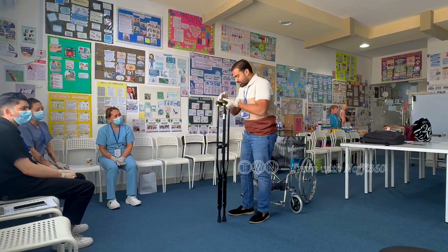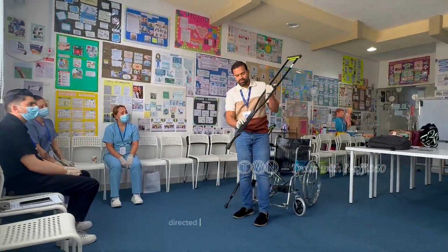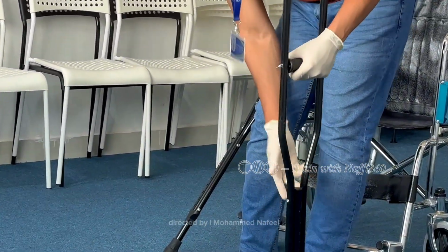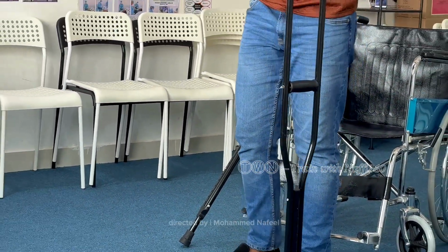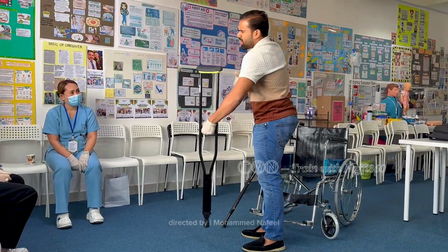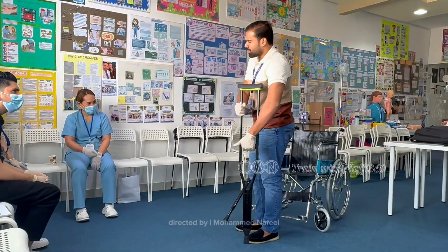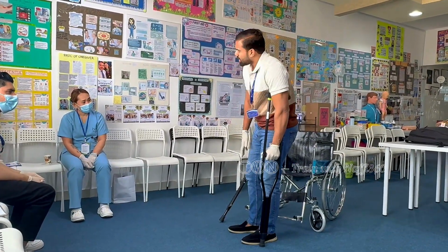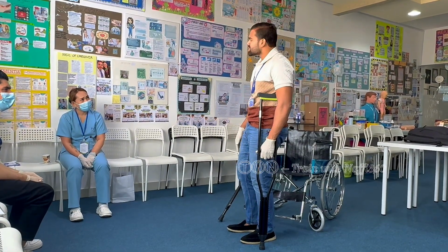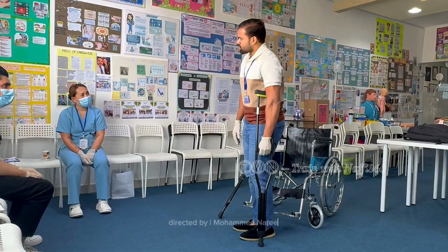Next, using crutches. We will introduce the crutches as a mobility aid. Proper use of crutches is essential for maintaining balance and supporting a patient's independence. Teach the patient to hold the crutches on the stronger side of the body. The crutches should stay on the stronger side. When walking, instruct the patient to move the crutches and the weaker leg forward together, followed by the stronger leg.